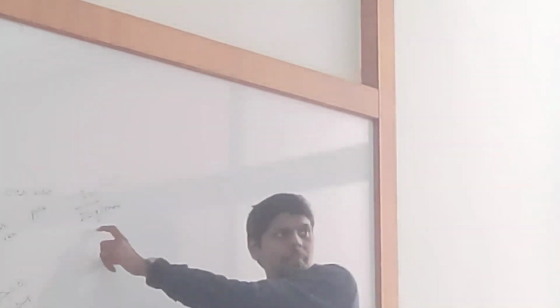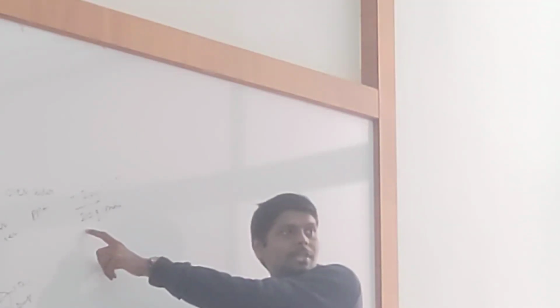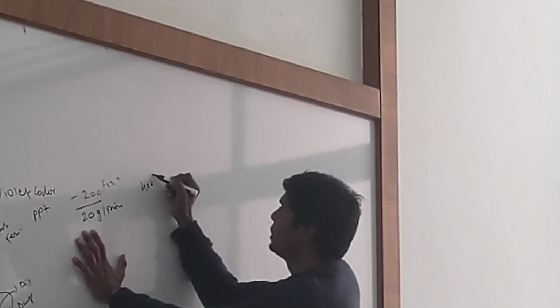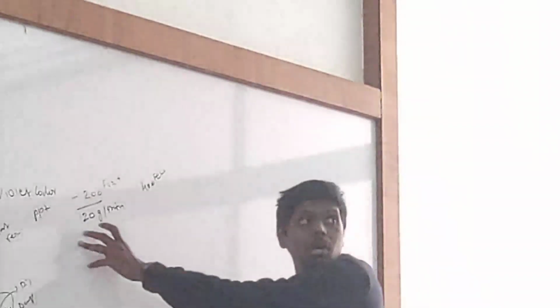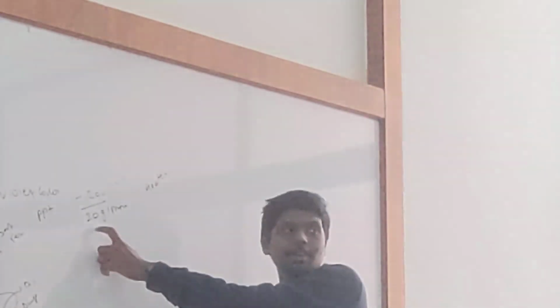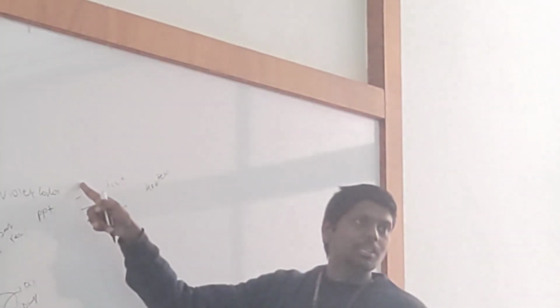Now, what is the total binding capacity of this protein? Is this protein able to take up to 400 iron molecules? I want to see the total binding capacity of this protein. I am measuring the protein value indirectly with iron molecules.